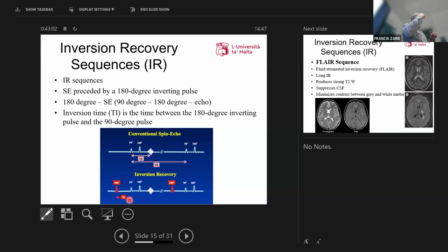Okay, but then they might not be spin echo sequences, they could be fast spin echo sequences, where the flip angle is not necessarily 90 degrees, it could be less. If it is less, it gets there faster, so to shorten the time you can change the flip angle, so instead of 90 it is less. So it's a faster sequence. But then the weighting might not be T2 as much as in spin echo, it might have a bit less T2 or a bit less T1, depending. Okay? But their purpose is that you subdue the signal from normal tissue and you enhance the signal from abnormal tissue. What I mentioned is about water. You can do the same thing for fat. So you have fat suppression sequences, fluid suppression sequences, and different types of suppressions.